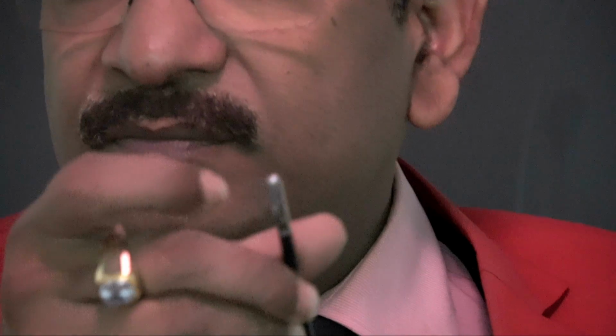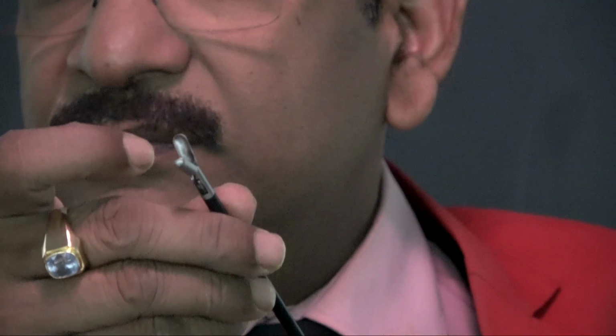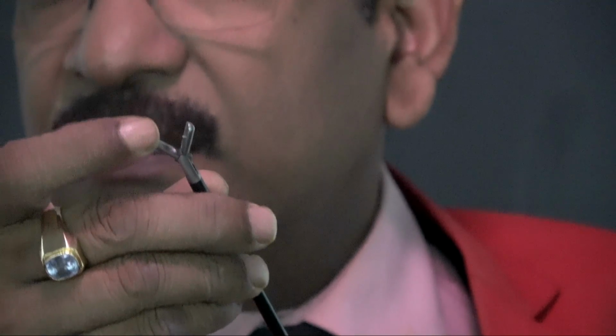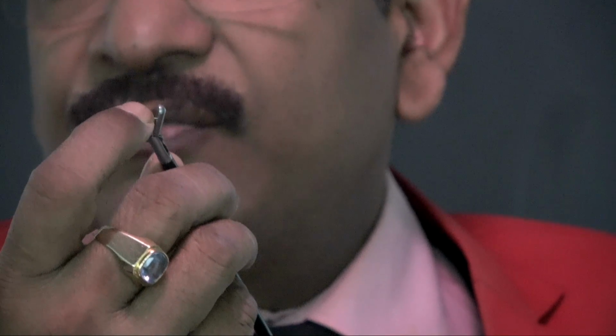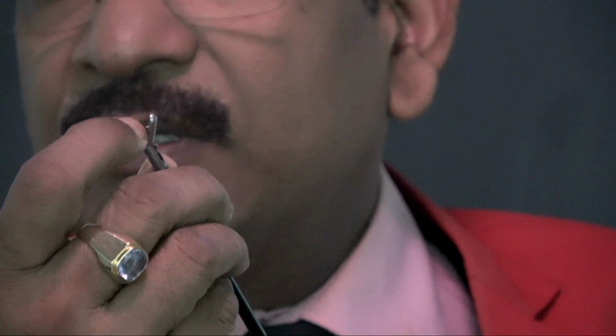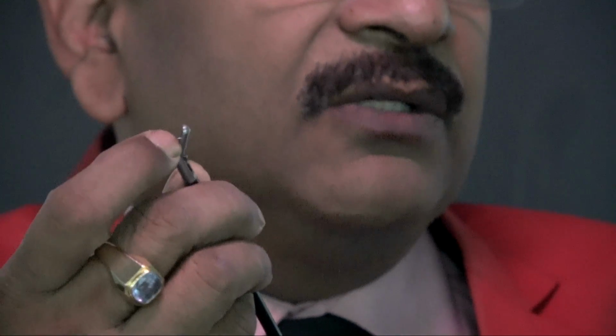This is the laparoscopic biopsy forceps I told you about. If you see here, it has a tooth inside. If you see it on the monitor, a little close up, there is a tooth there. And the tip is completely smooth. So if you see here, a tooth will be visible inside. Here, can you see this? Here, there is a needle inside. Here, this one. Did you see that? This one. So there is a tooth.